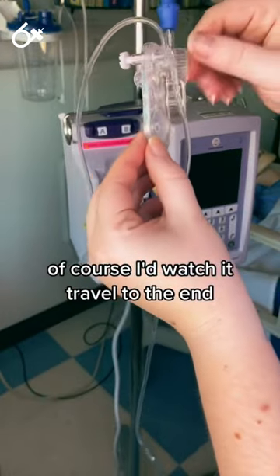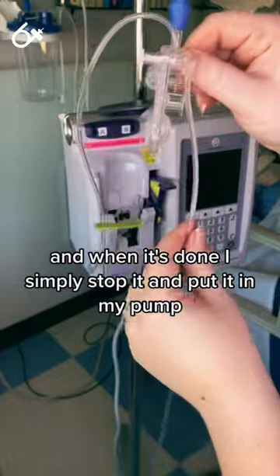Of course I'd watch it travel to the end, and when it's done I simply stop it and put it in my pump.